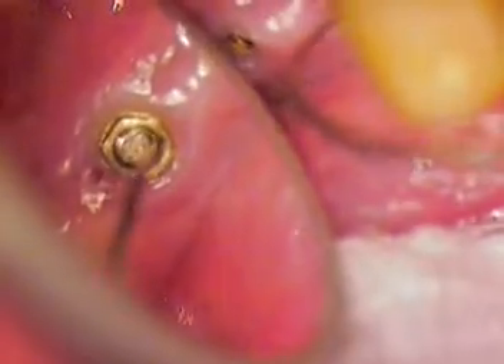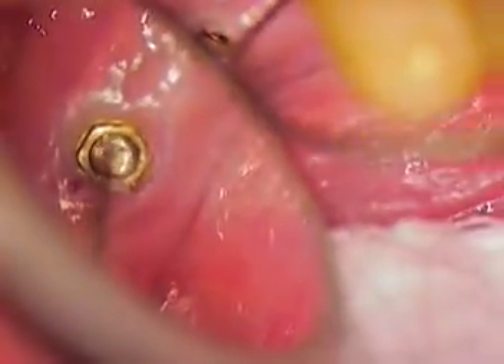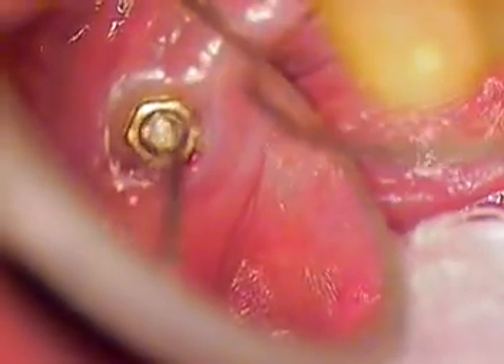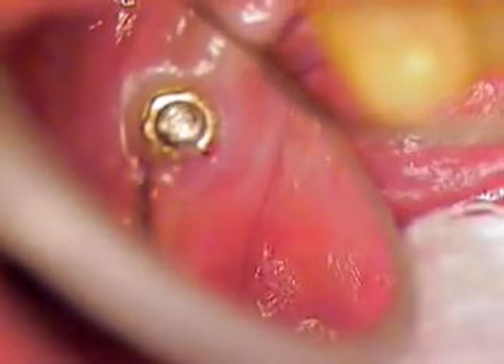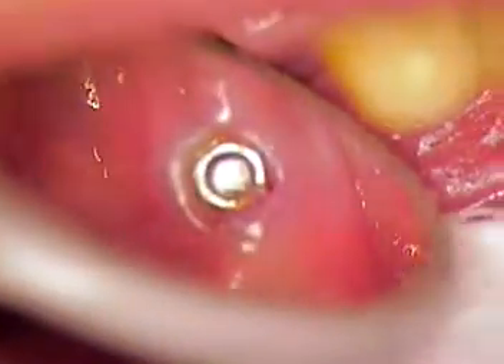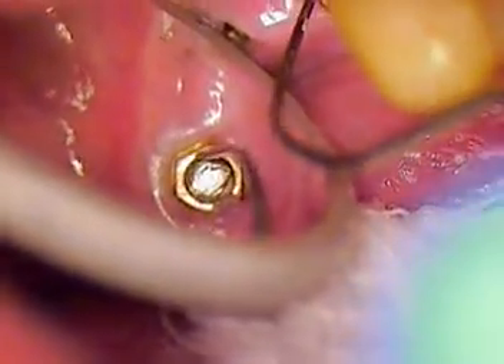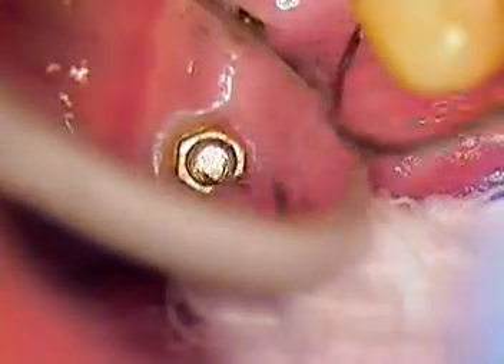Now once we get it to this point, it's only going to be a small little piece, so we'll suction that up and put it aside. Here it comes. There we go. I'm still working with the threads going counterclockwise — always lefty-loosey even in this world. Out it comes. Maybe one or two more threads to go. Maybe I can get those with my finger if I can go in there. They're very small.